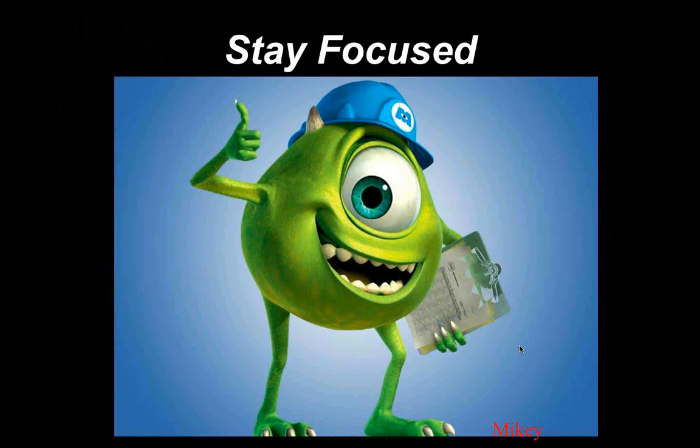I've had really good luck with front surface torics and using toric peripheries on these, and it's amazing. Even as little as a half diopter, but typically, like in a regular scleral, or on a regular toric, you're looking for about 3/4 of a diopter more of cylinder residual that needs to be corrected.